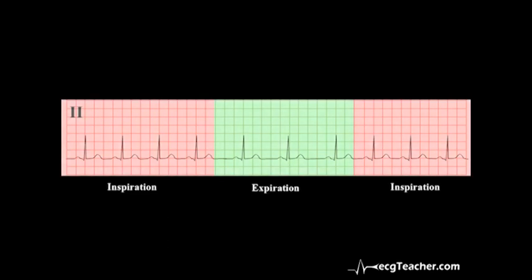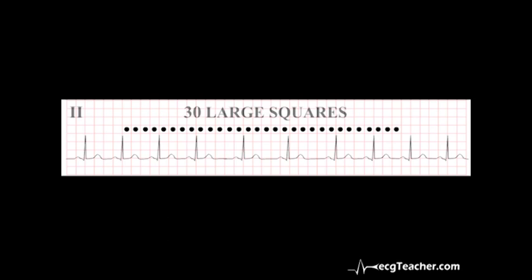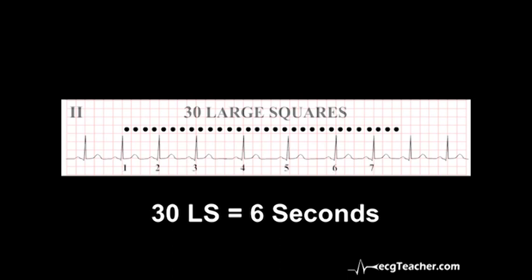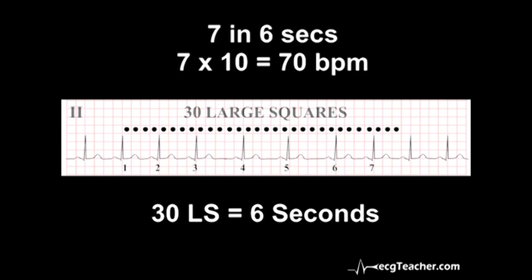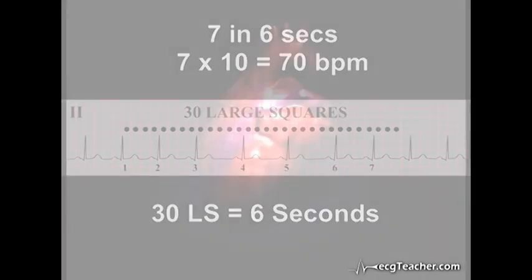We cannot use the RR interval technique to calculate heart rate in this case, as the RR interval varies. When calculating the heart rate from an ECG in the presence of an irregular rhythm, count out 30 large squares. Now, remembering that 5 large squares equates to 1 second, 30 large squares corresponds to 6 seconds. Count the number of R waves in these 30 squares. In this case there are 7. 7 beats in 6 seconds gives a heart rate of 70 beats per minute.